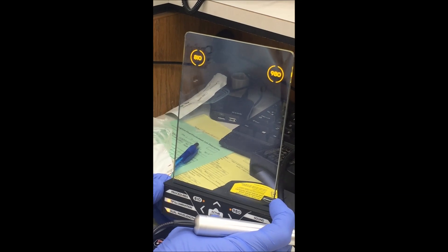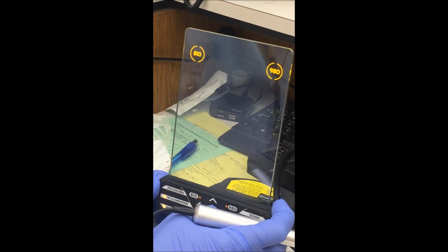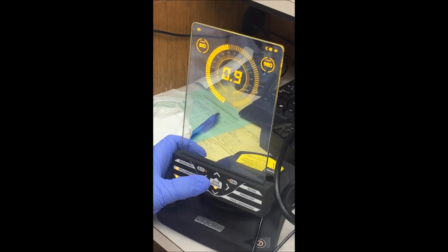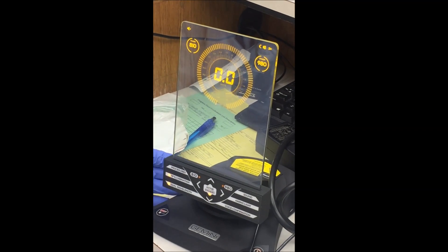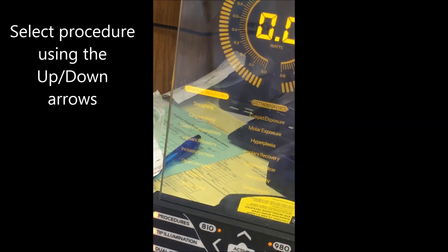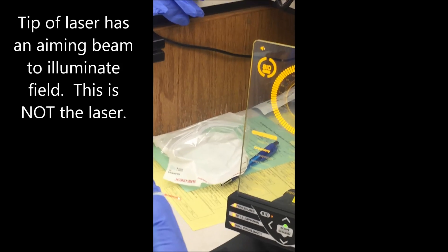We're going to put the laser on standby and then put it on active. It takes a little time to get going, so we're in standby right now. We're going to look at our procedures — we're in the general dentistry set and we're going to be doing a gingivectomy. We'll select gingivectomy, then put the laser on active. You can see that the tip lights up to help illuminate the field.